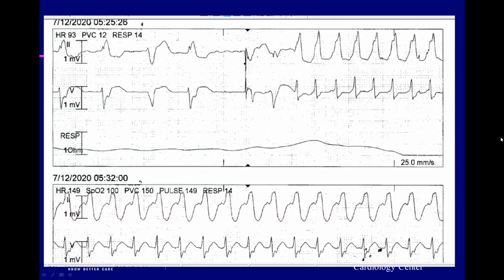Mansoor sent me this, and I want you to take a look at it and tell me what you think this might be. What I don't want you to do, if you get a 12-lead EKG with a wide complex rhythm, is look for AV dissociation. Look for the morphology criteria. It's much, much easier and quicker. Okay, what do you think, guys?